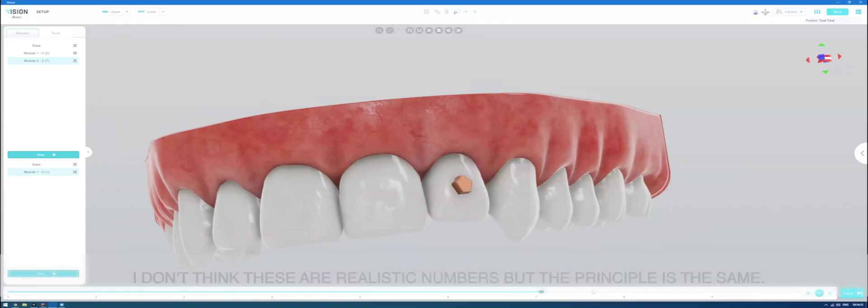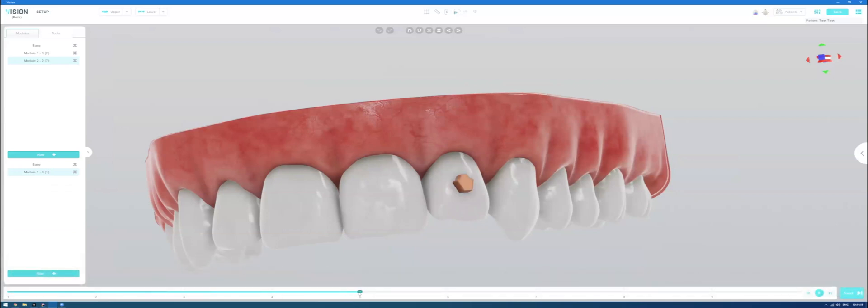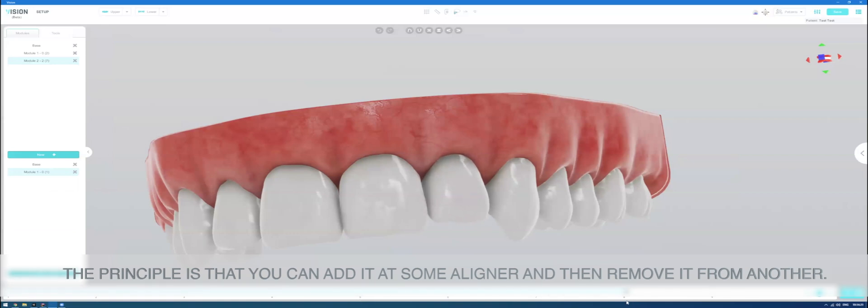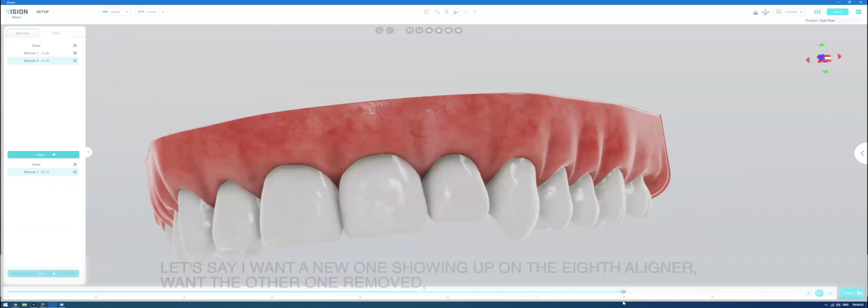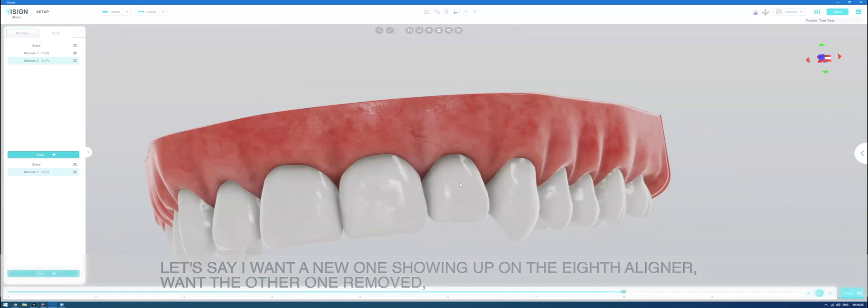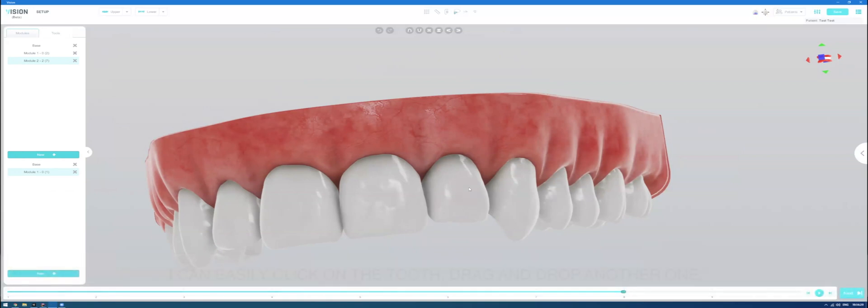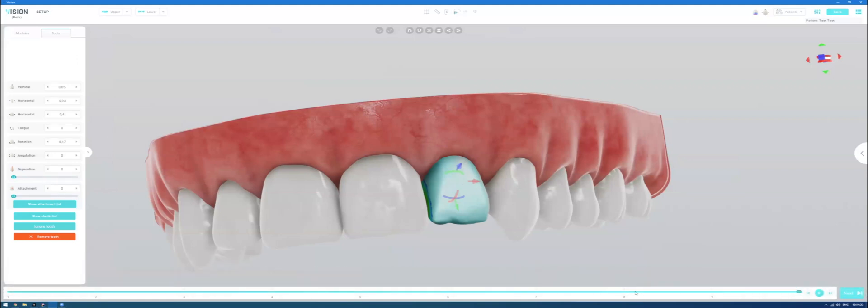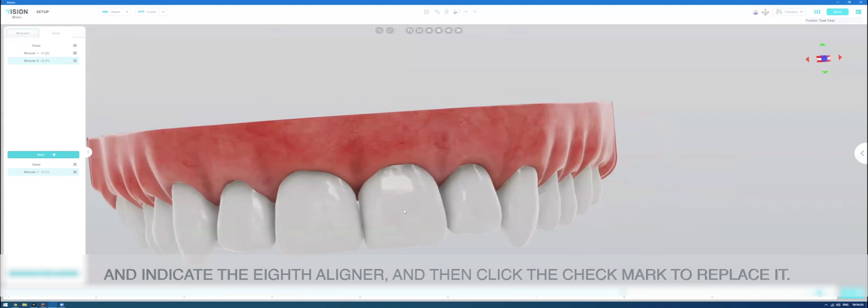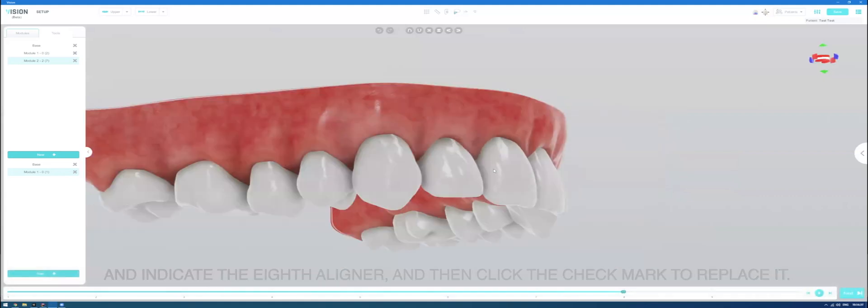These are not, I don't think these are realistic numbers, but the principle is the same. The principle is that you can add it at some aligner and then remove it from another. And let's say I want a new one showing up on the eighth aligner. want the other one removed, I can easily click on the tooth, drag and drop another one and indicate the eighth aligner and then click the check mark to replace it.